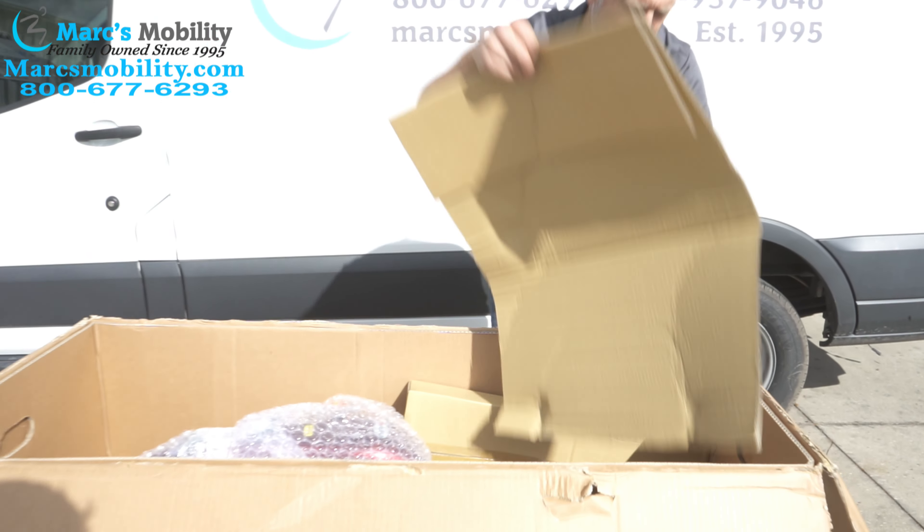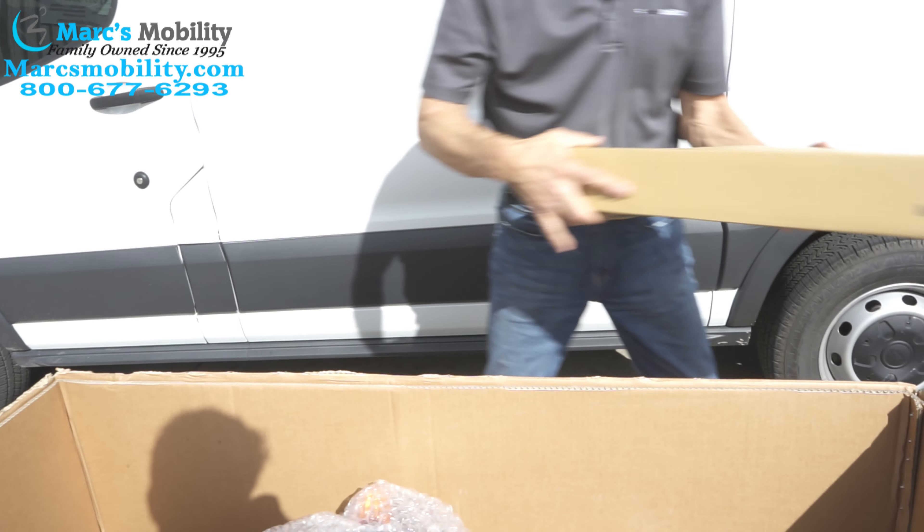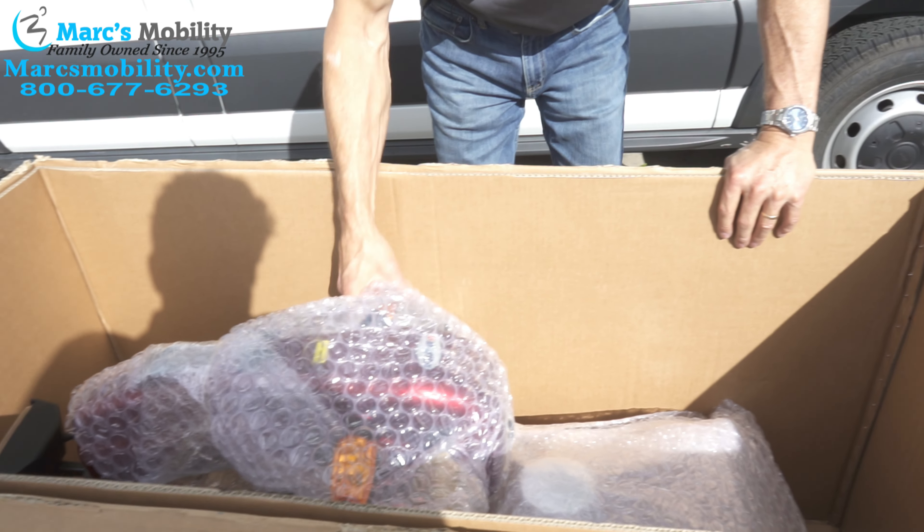Then you have a cover. Pull the cardboard out. Then you have some more parts in here — these are probably going to be the arms. And then you have the tiller right here.